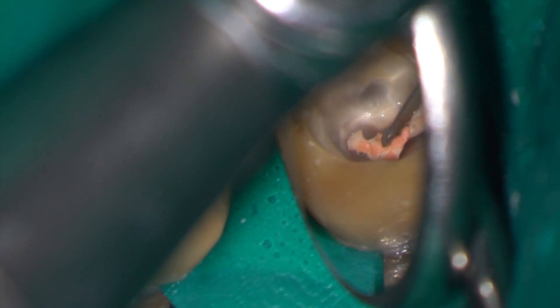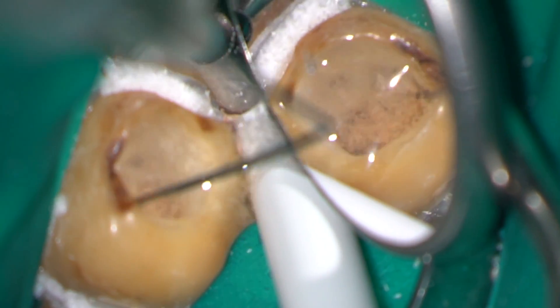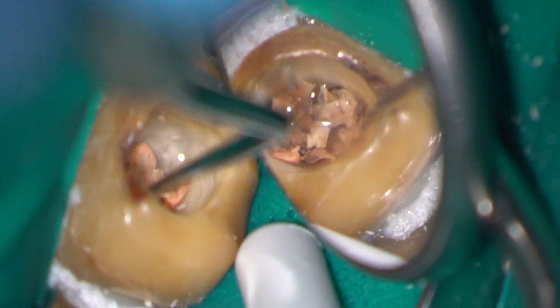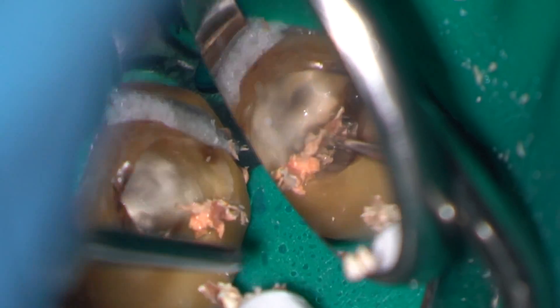Here I'm using a Gates Glidden No. 2 to remove the gutta-percha. After irrigating with 3% sodium hypochlorite, I'm using my DG16 endodontic probe to remove fragments of GP from the orifices of the root canals.